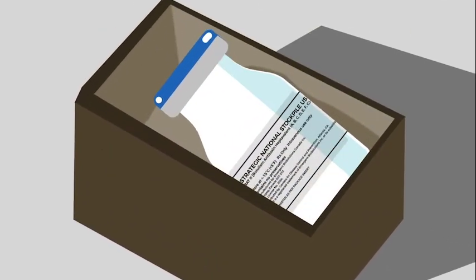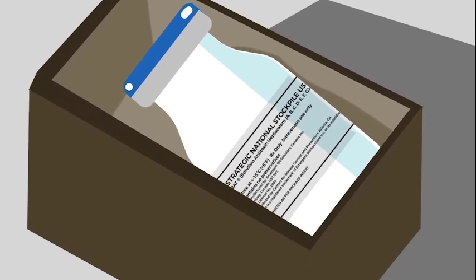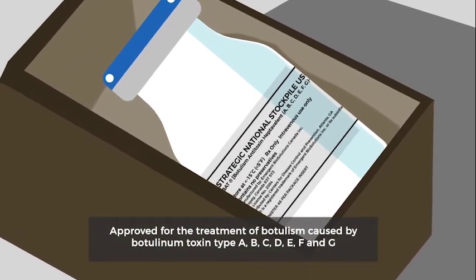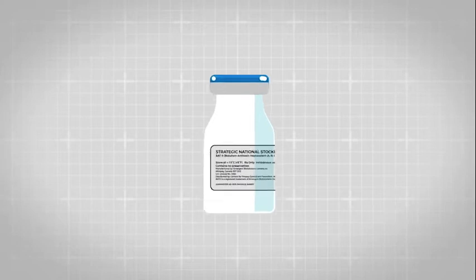Botulism antitoxin is made from the plasma of horses. It has antibodies that neutralize the toxins. FDA has approved the antitoxin for the treatment of botulism caused by botulinum neurotoxins type A, B, C, D, E, F, and G in people of all ages. An illustrated box appears. The box lid is removed to reveal a bottle of botulism antitoxin. The antitoxin is a clear colorless liquid.